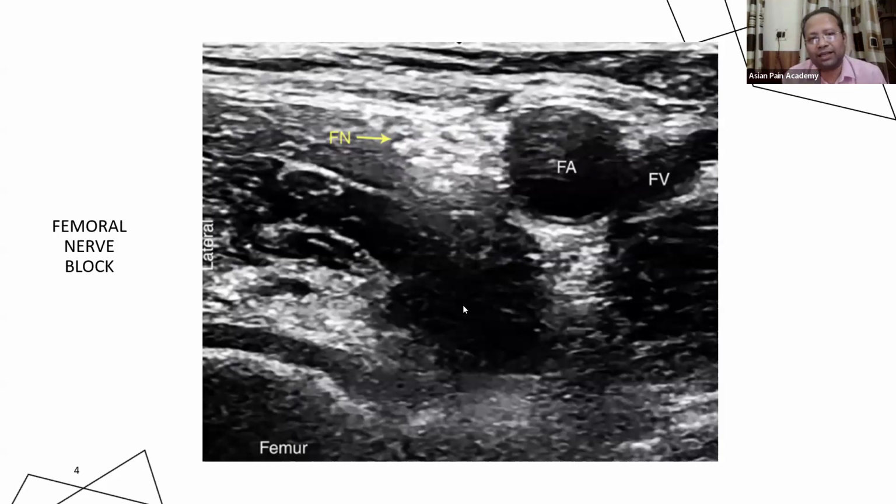The same technique is actually used at another place in ultrasound: the search for the peroneal nerve in the thigh. We search for the peroneal nerve just at the margin of the biceps femoris muscle. So it is the same way. This is the iliopsoas muscle.